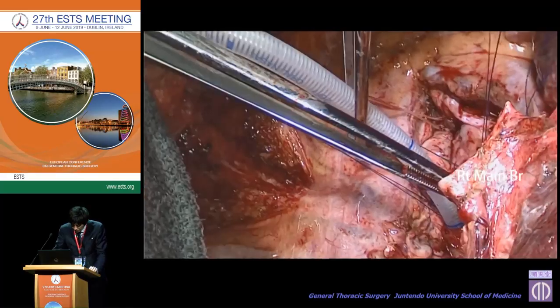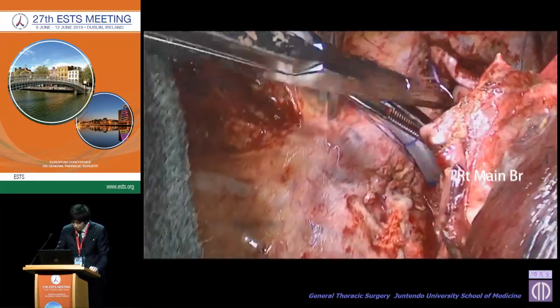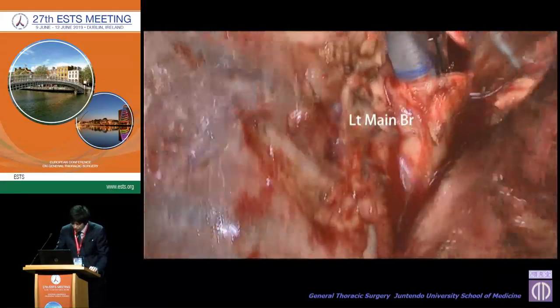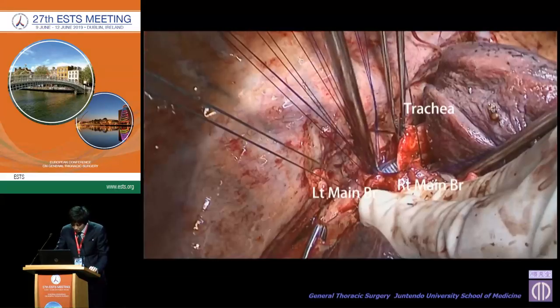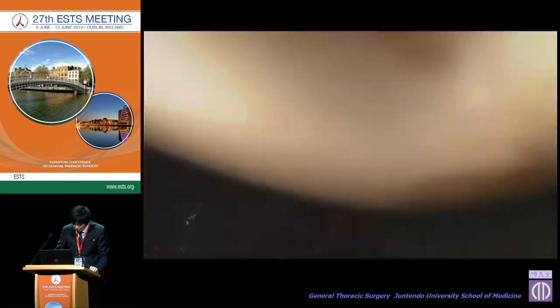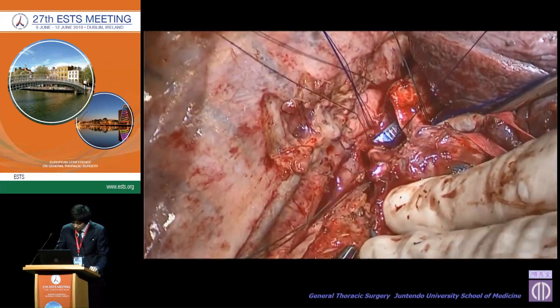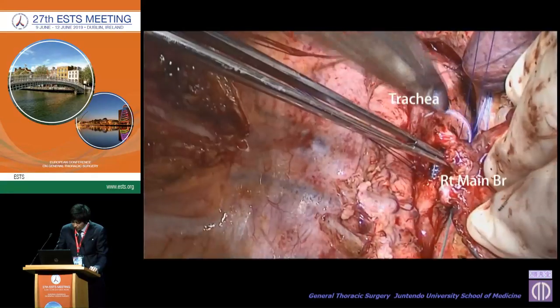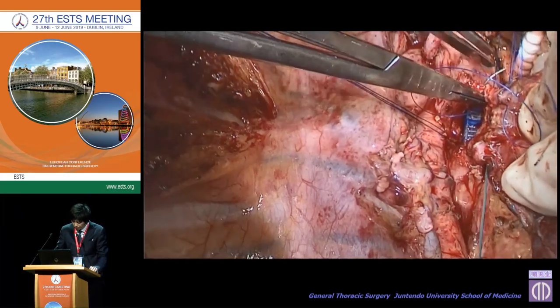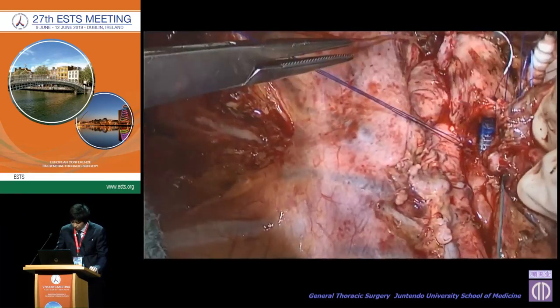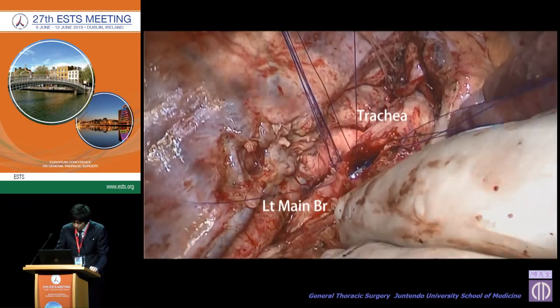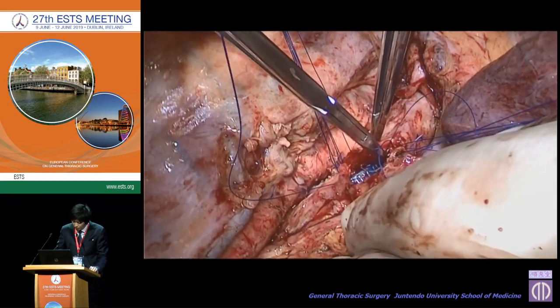Then we started to make a new carina. Interrupted sutures between the right main bronchus and the left main bronchus were performed using 4-0 PDS, with a total of 5 sutures. At the new carina, ligation was intraluminal. Interrupted sutures between the right main bronchus and trachea were then performed. Finally, the membranous side of the trachea and both main bronchi were sutured with 3-0 Prolene.